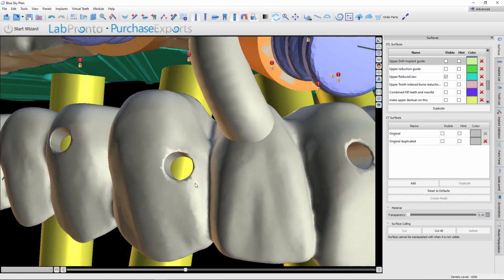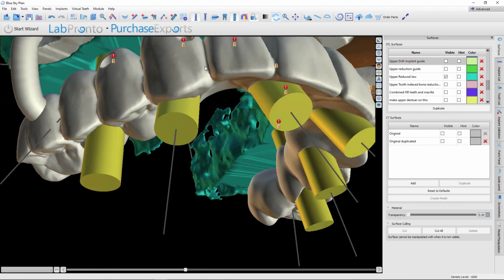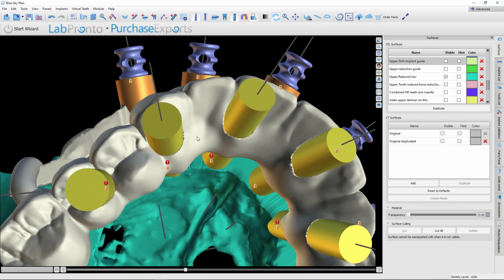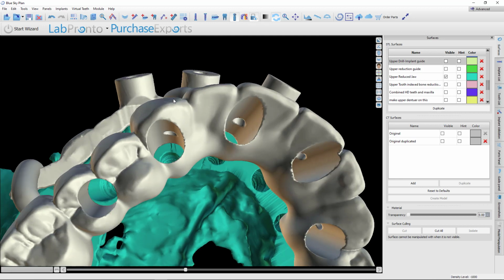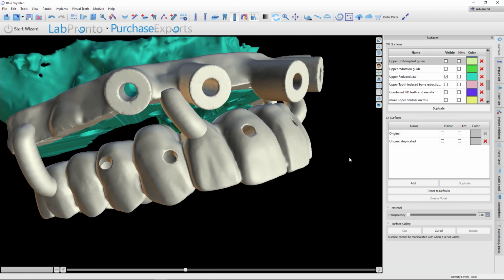Now, if you wonder what these are, it can be difficult sometimes to get in here. If you've got a cylinder emerging in here, these are pretty precise holes. Your cylinder is probably 3 millimeters. The whole hole here is 5. It can be difficult to squirt the acrylic in there, and salt and peppering it just takes forever.